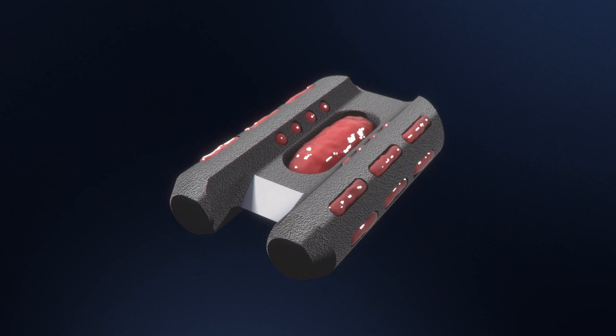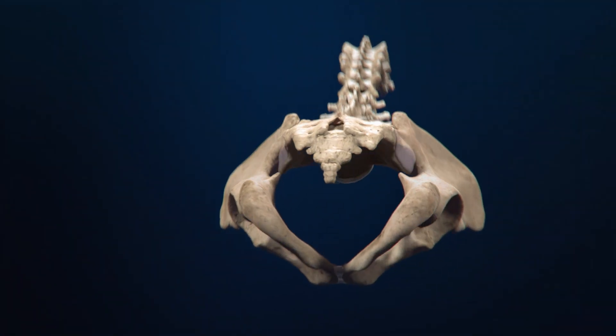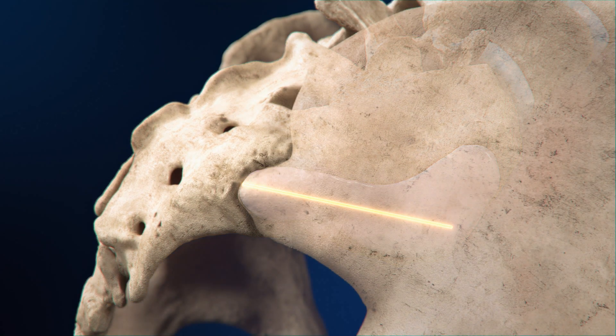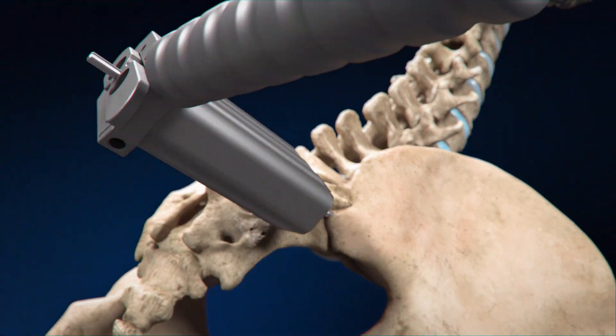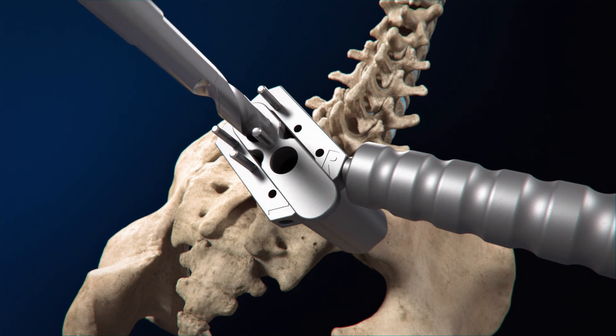The Catamaran fixation device is designed to help facilitate an authentic arthrodesis. The Catamaran procedure uses an inferior posterior approach where a graduated guide wire is placed along the articular portion of the SI joint, establishing the trajectory. K wires secure the access sleeve and drill guide to the sacrum as the first pontoon channel is drilled.